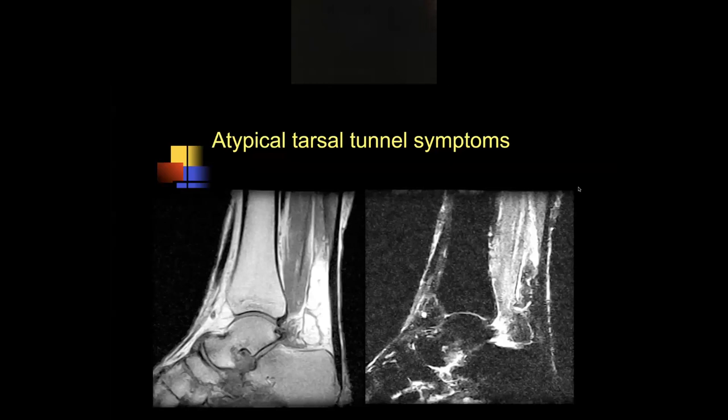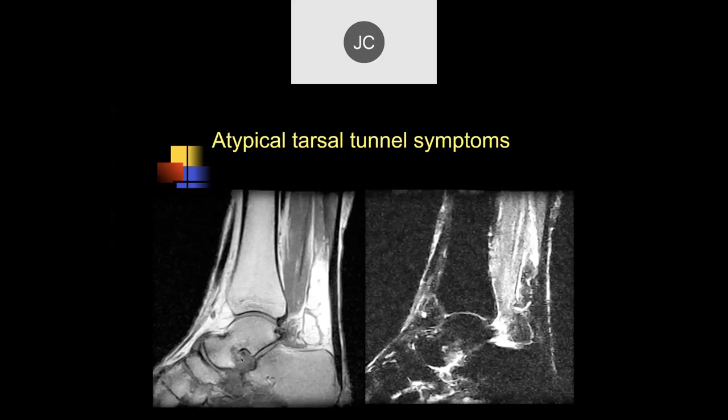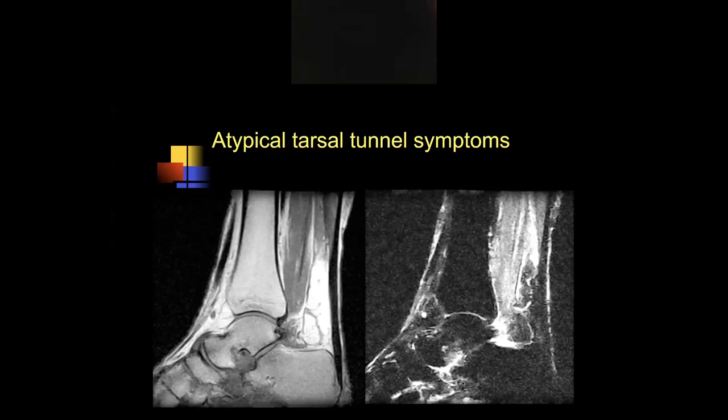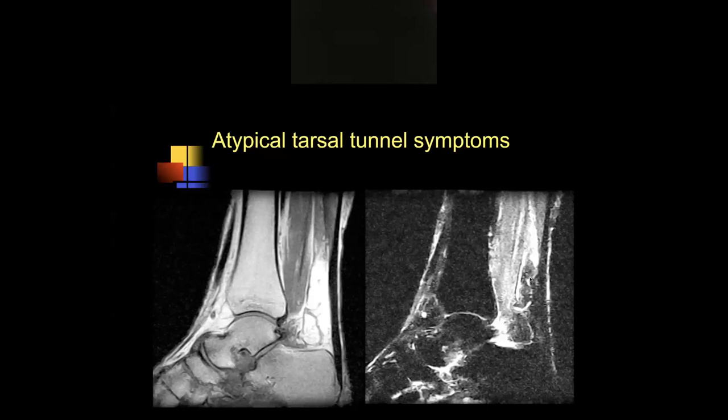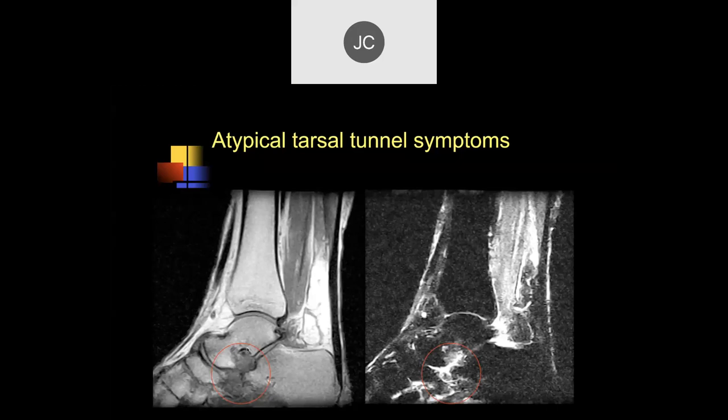There is, it's either edema in the Kager's pad. I'm sorry, edema where? Are you talking about this? No, I'm talking in front of the Achilles tendon. Oh, here. Back, yeah. This area here? Or back here? Yeah, all together. Oh, okay. All righty. We're looking at the... okay.